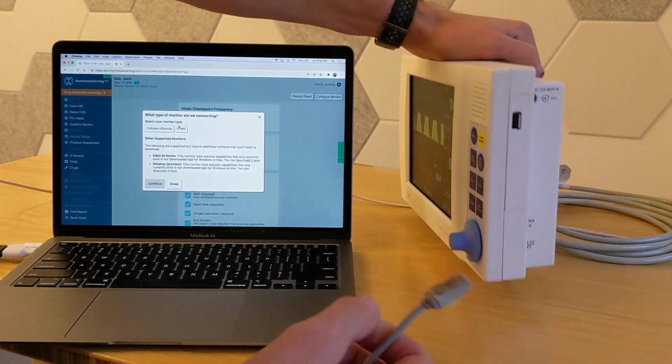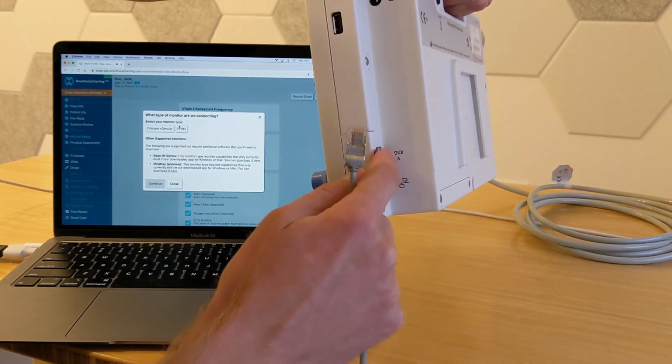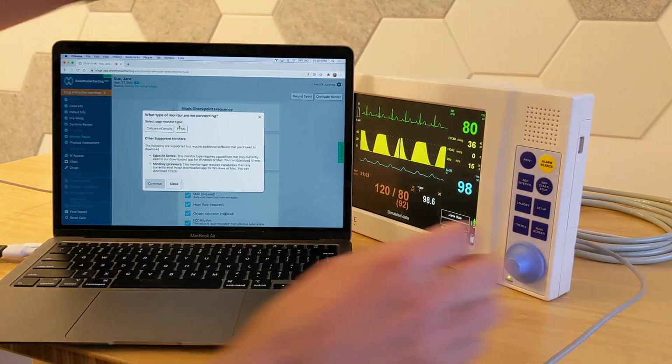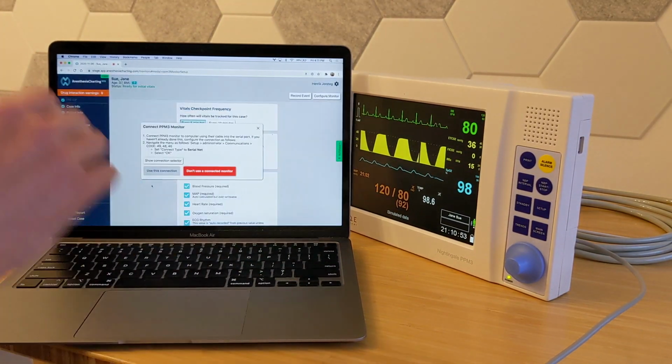But basically, we're just going to take this and plug it into the 1s and 0s outlet here on the back. It's not the Ethernet one, it's the one above it. I'm going to plug that in. There we go. And at this point, I should be able to now connect the two. So I'm going to select PPM3 and hit continue.